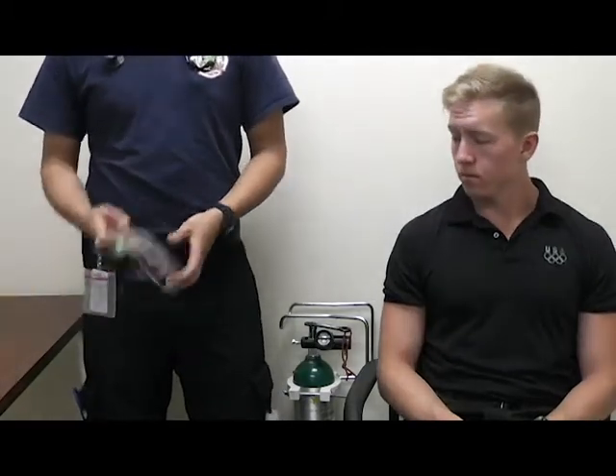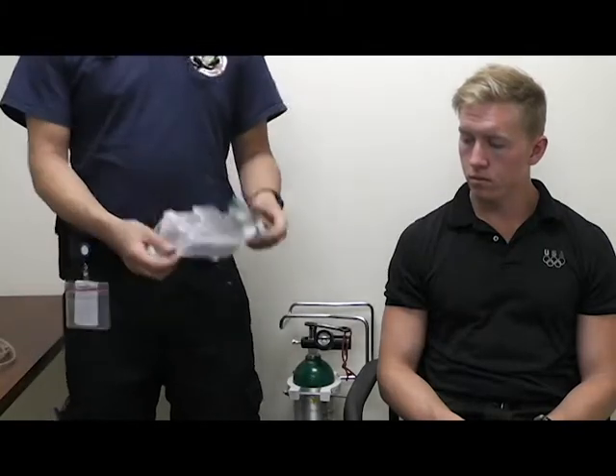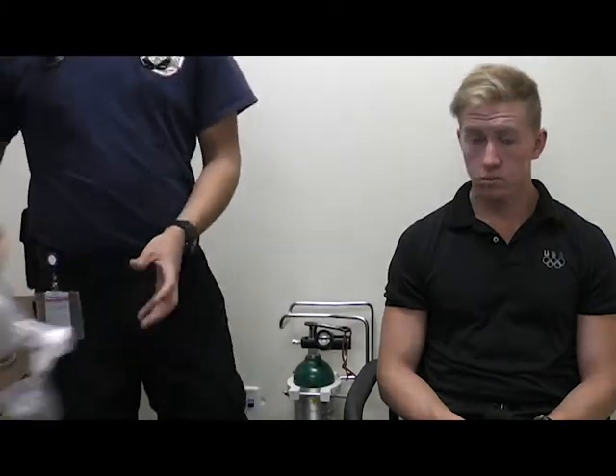This is a demonstration of the different ways you can administer oxygen to a patient. The three main methods you're going to be using are a nasal cannula, a non-rebreather mask, and the BVM.